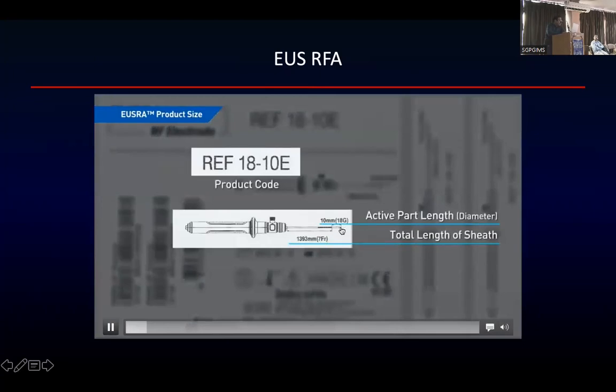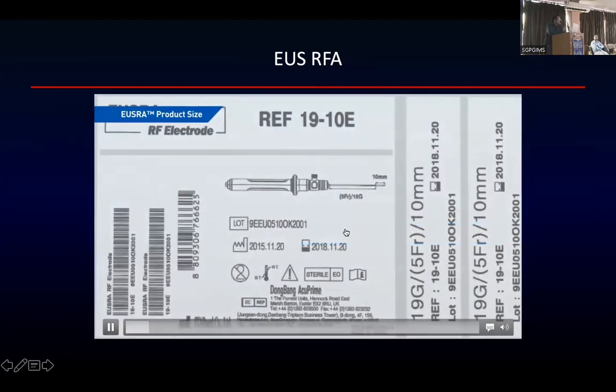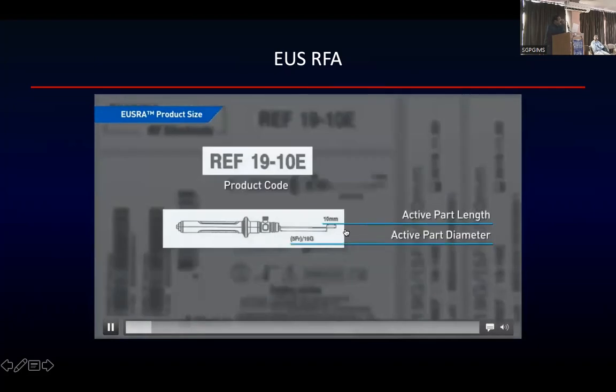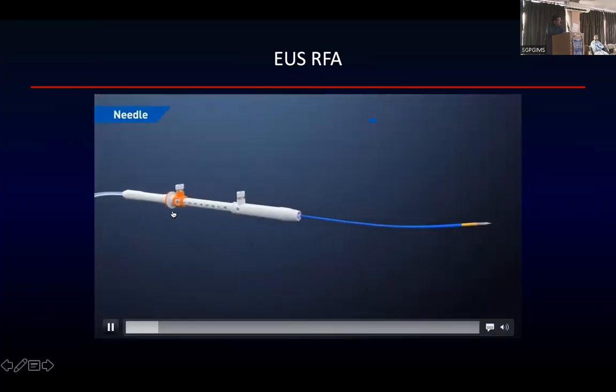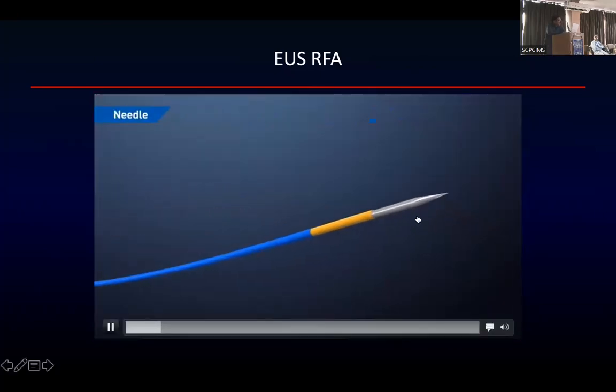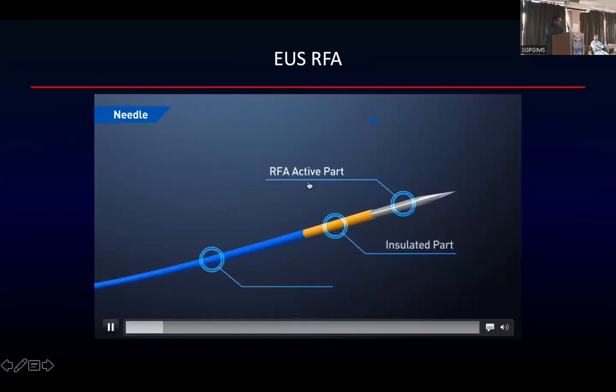You can see the tip part is the active part, which will bring about the ablation or the coagulation of the tissue that you need. And if you see, this is the whole device that is available. This is similar to your FNA needle. This is the part which is the RFA active part. This is the insulated part to prevent further damage to the tissue. And this is again the sheath that we have.